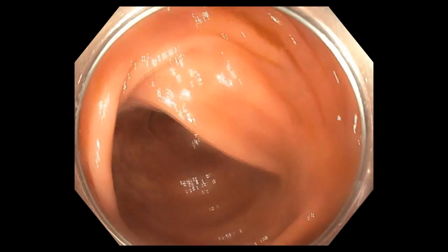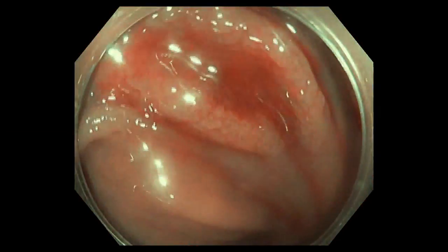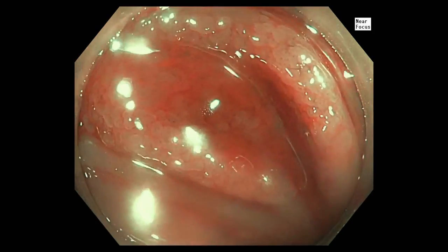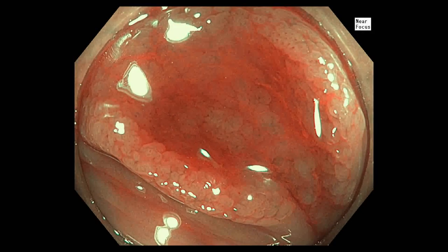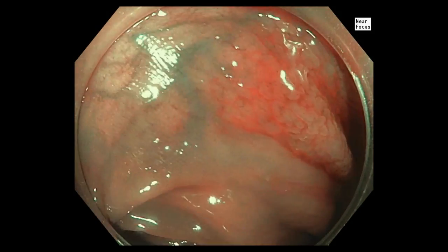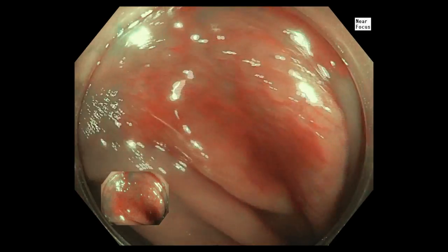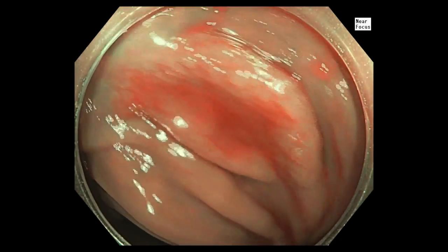This video demonstrates a typical sessile serrated polyp. It is initially difficult to see, but the key features are a slight granular surface with adherent mucus. Here, viewing it under both white light and narrowband imaging, we can more clearly identify the lesion and identify its borders.